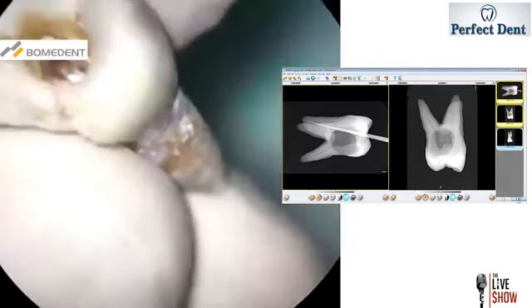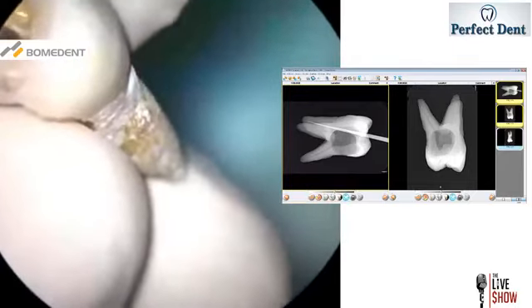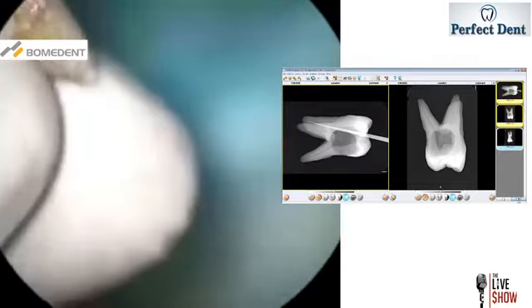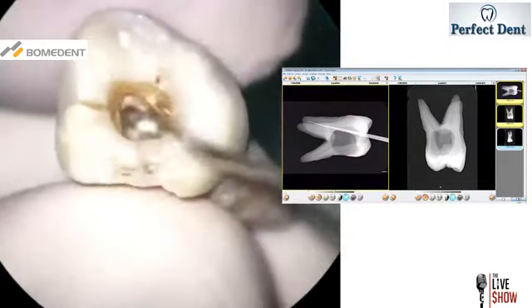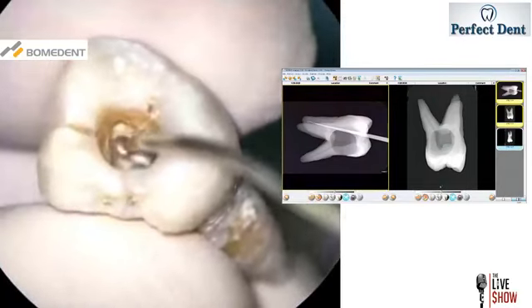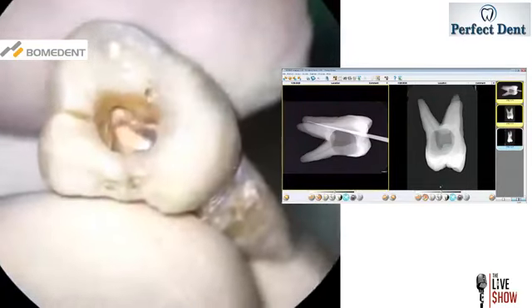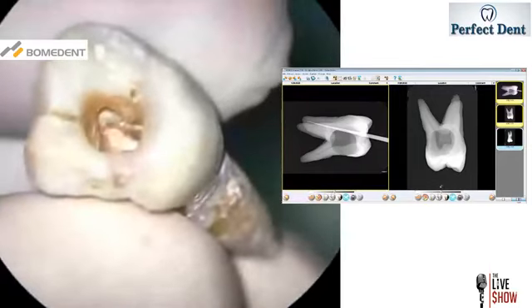And then we will have the last phase. Okay. And then I would do my backfill using this, you can see there, and I will inject, fill up the canal backwards. Plugger, please. The blue one.